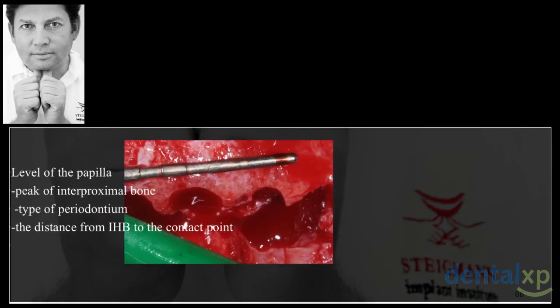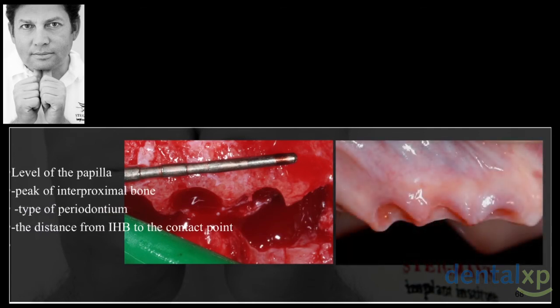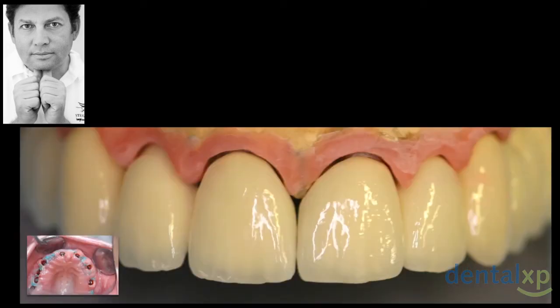So in these cases, this is what we have to create the soft tissue on top of it. Because we know when we have multiple adjacent implants, this soft tissue needs bone underneath. And in these multiple implant cases, we have to create the bony frame underneath. And if time allows, I will share with you how we do creation of these multiple cases.